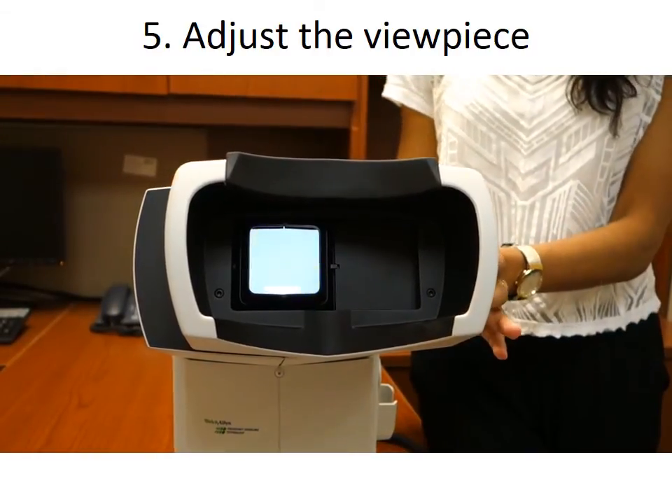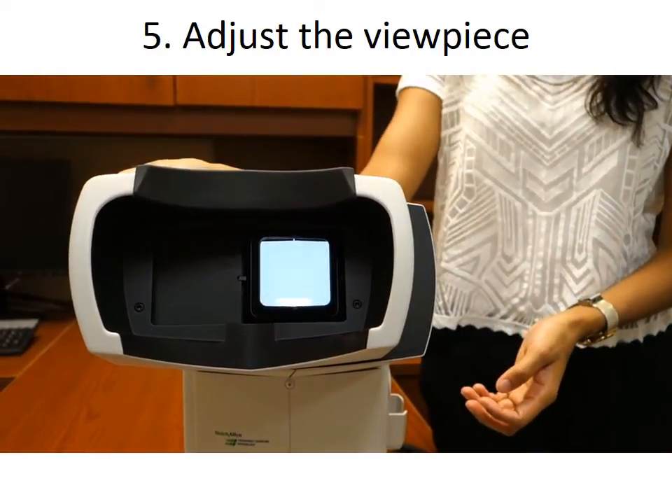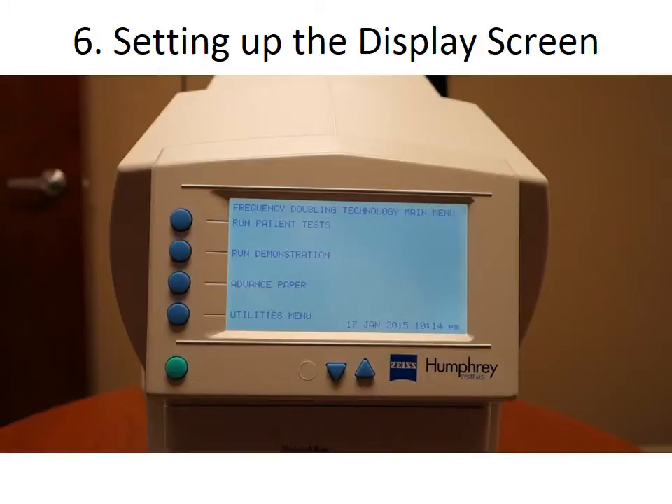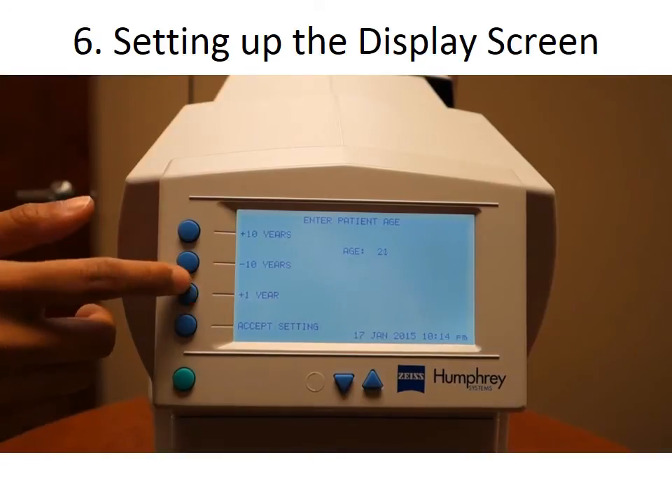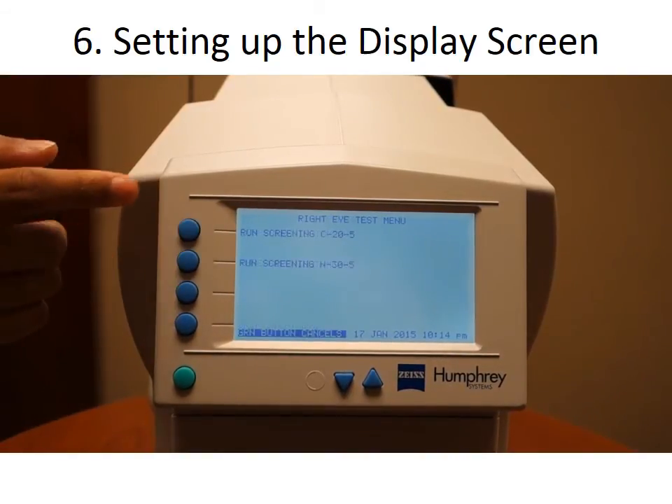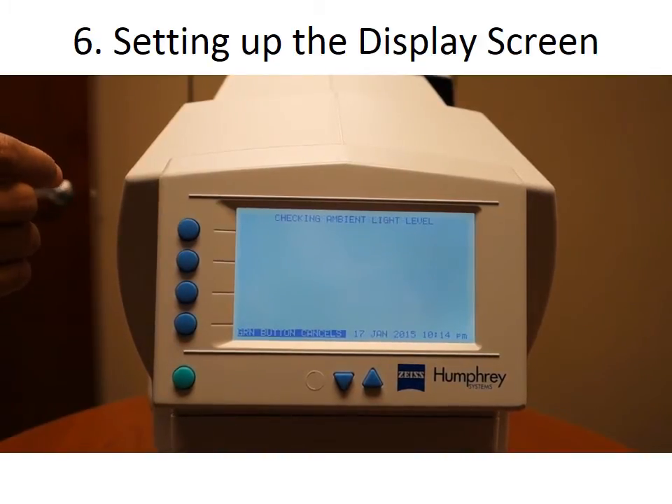Before entering data on the screen, adjust the view piece to the correct position. If you are testing the right eye, slide the view piece so that it is to your right when looking at the home screen. If you are testing the left eye, the view piece should be on your left. From the main menu, select Run Patient Tests using the blue button. You will then be prompted to input the patient's age, then select the screening test type called Screening C20-5. The machine will then go through the calibration process and the test will start automatically.